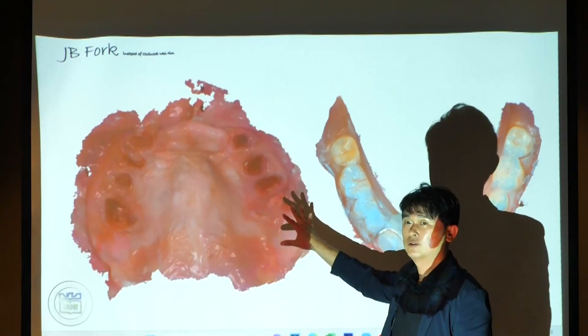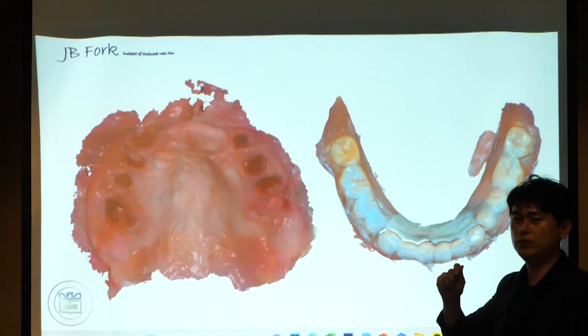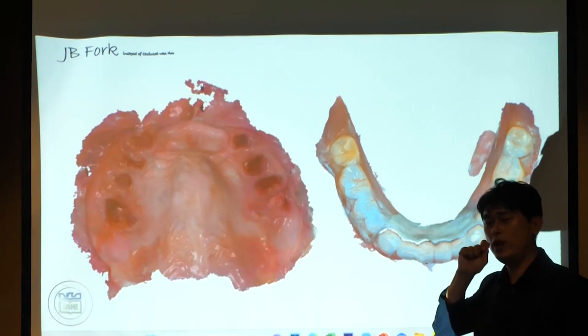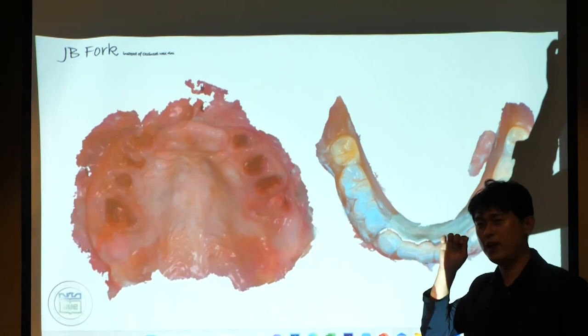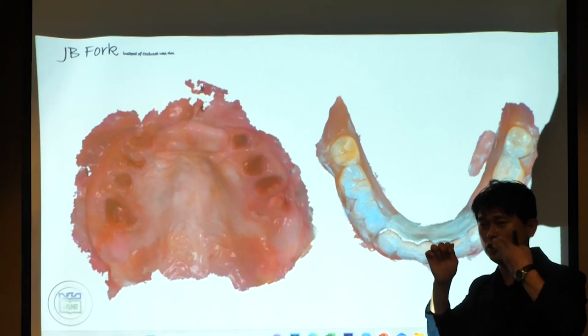If your dental hygienist does this oral scan, you have to train them. Anyway, after retraction, at one point, the hand must not move. Stop, okay, and then scan. Then another part can be retracted and then scanned, attached. Scan attach. It's very important.